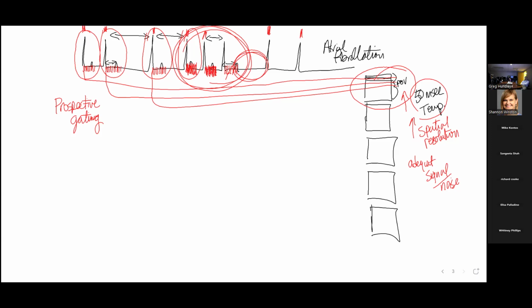As long as it's regular, you can have the scanner go back and reorganize with retrospective gating, you're in great shape. If it's atrial fibrillation, then we pretty much need that QRS complex because we're going to switch to prospective gating, and we've got to have a repetitive component where we always see end diastole and we appreciate end systole. Okay.